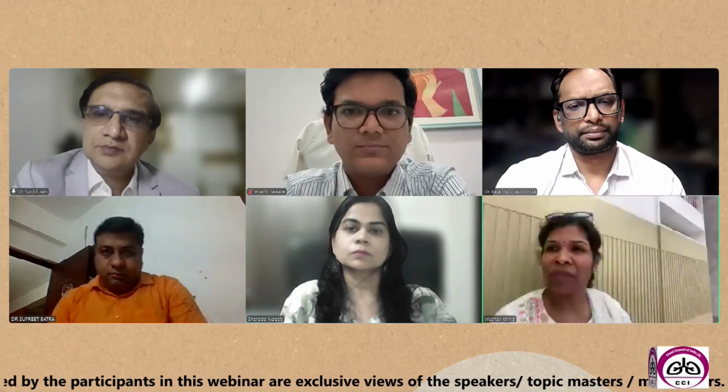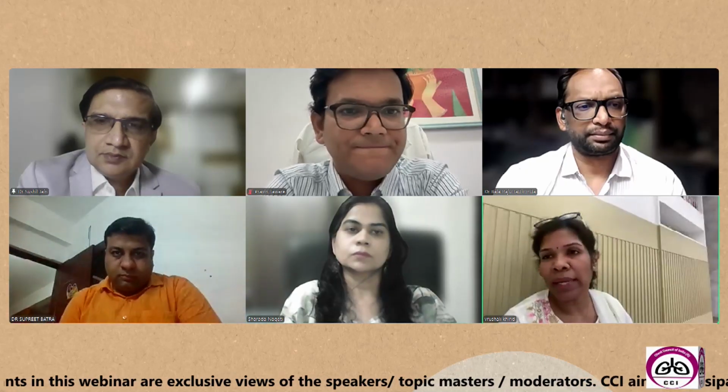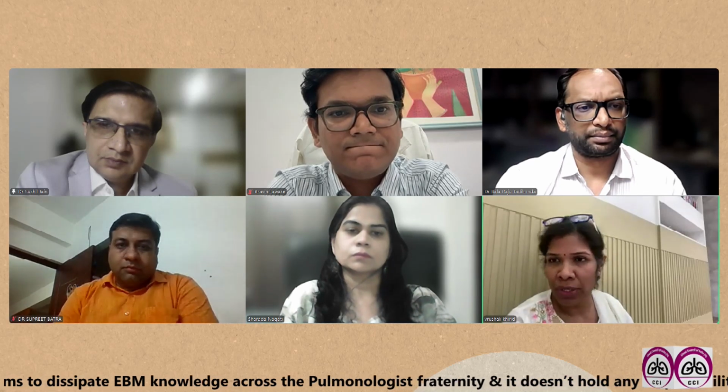Good evening, everybody, and thank you for the question, sir. Basically, your pre-test probability of a benign versus a malignant lesion is where you decide whether you want a PET CT. With a benign pretest probability, I wouldn't really go in for a PET CT. But if malignancy is on the cards, then definitely PET CT helps us in deciding the lymph node stations. Like you yourself mentioned in your lecture, you go from the N3, N2, you go to the farthest lymph node.